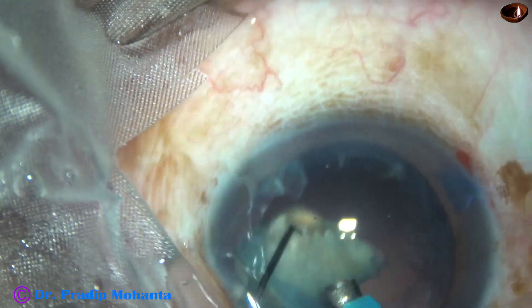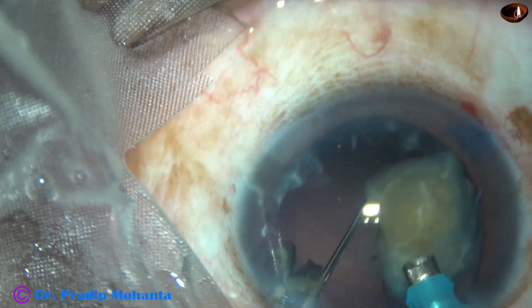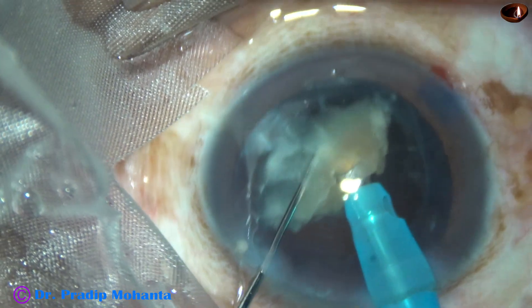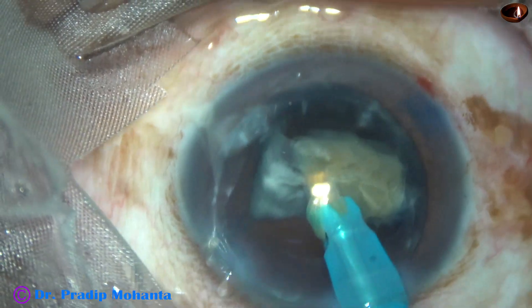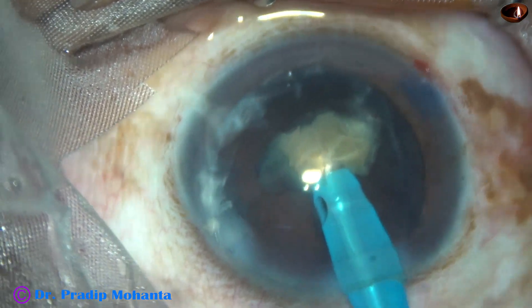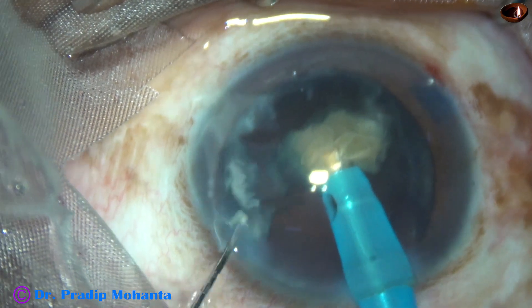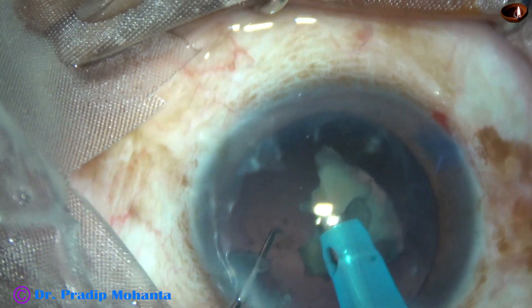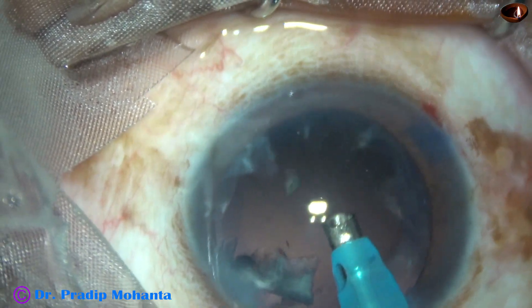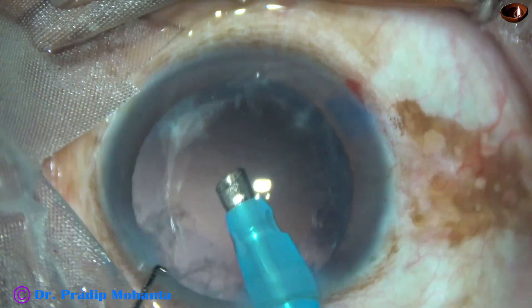The endonucleus is very stable and okay in this case. During emulsification of the last piece, we can decrease the vacuum and flow rate. In this case, I used only 100 mm of mercury vacuum, 20% ultrasound, and 20 ml per minute flow rate.